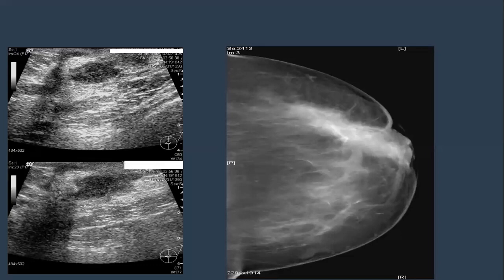In a case of chronic abscess. Excellent. Chronic abscess.